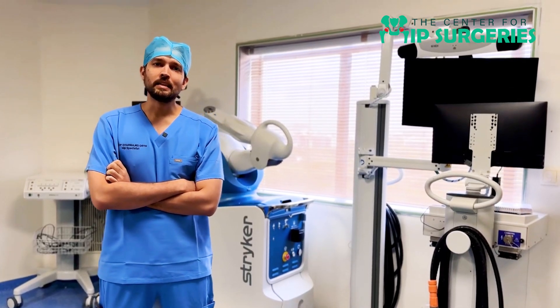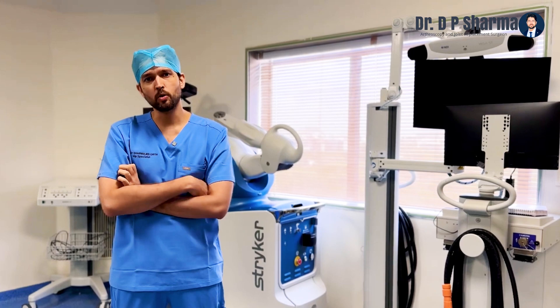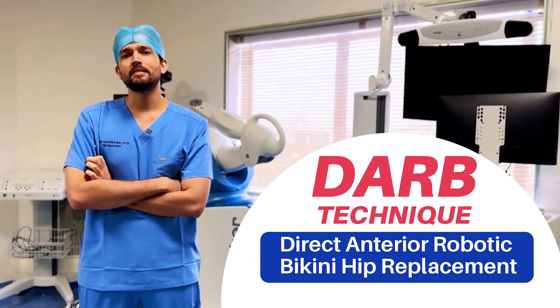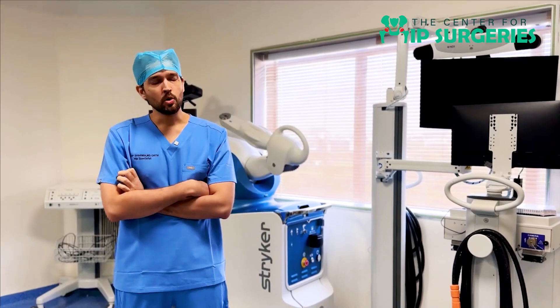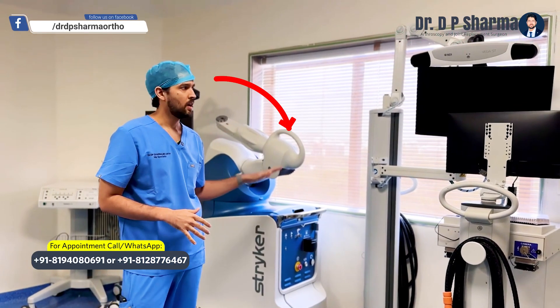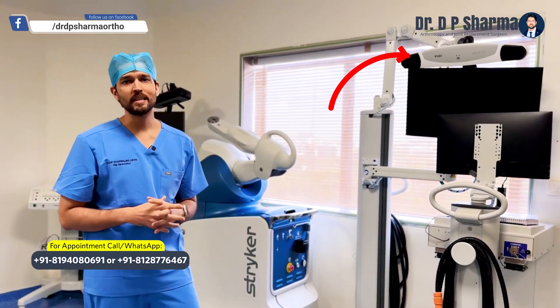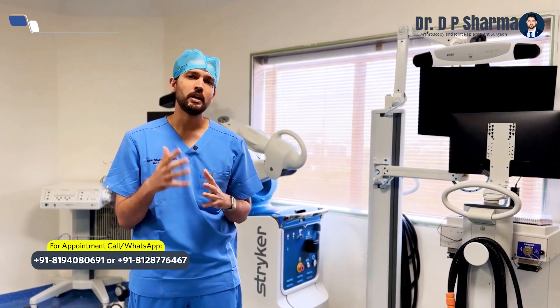Today we will be discussing the new generation of robots — Hip 4.0 of Mako Stryker. This is the robot; this is the part where the robotic arm attaches, and this is the eye of the robot — basically the camera of the robot.